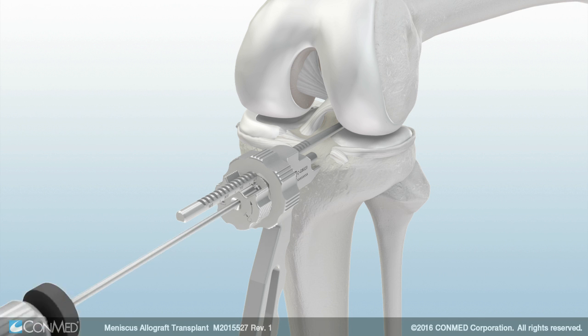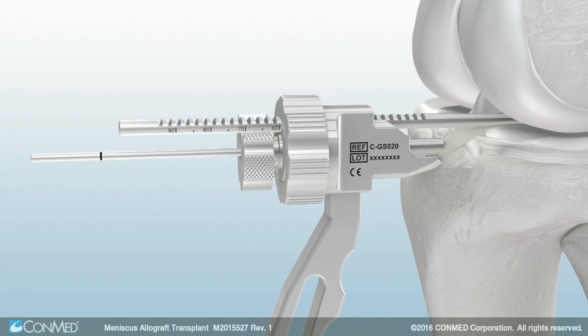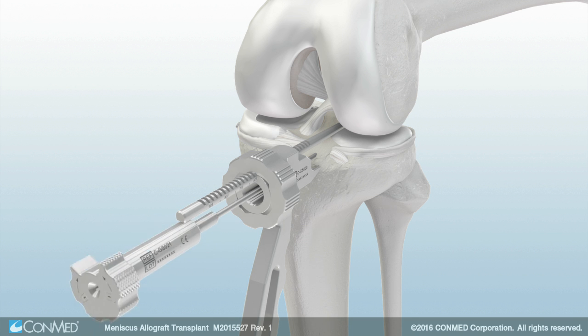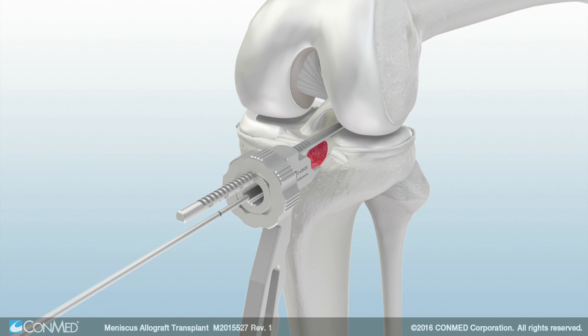Then insert and drill the 2.4 mm drill until the depth stop is engaged. Replace the drill with the 2.4 mm pin. Insert until the mark on the pin aligns with the back of the guide's alignment arm, then remove the sleeve. Align the 10 mm drill over the pin and drill until the depth stop is engaged. Once complete, remove the guide from the joint.